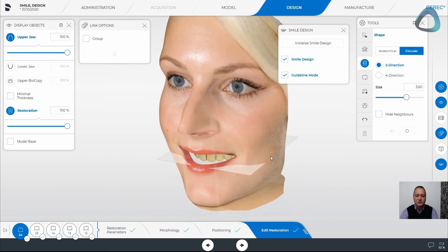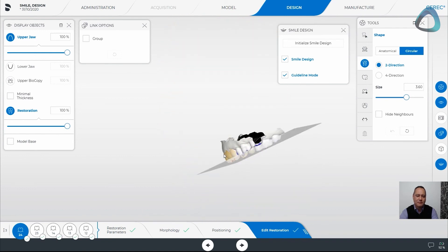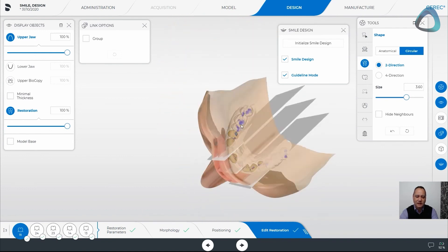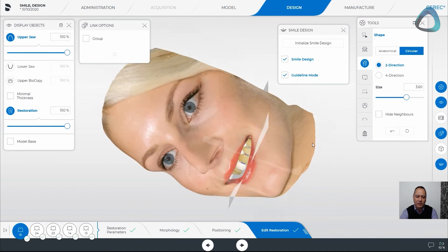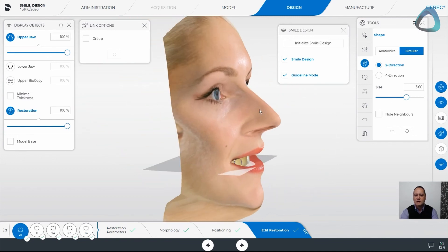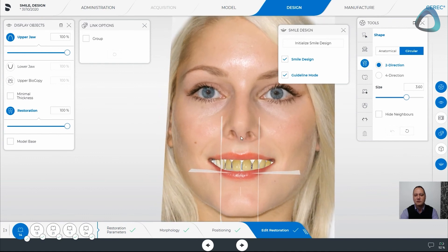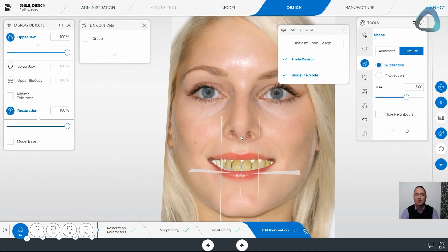I think we'll see further development with this where we can actually take it into a secondary and third plane in the future. But right now it's a visual guiding system to review prior to going ahead with the patient. Hope you enjoyed the smile design — chat to you guys soon.